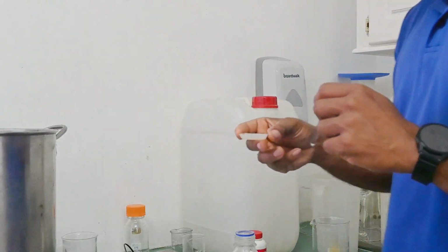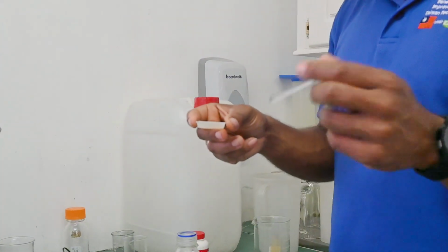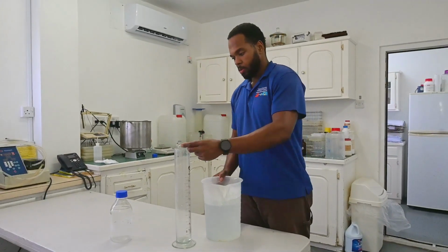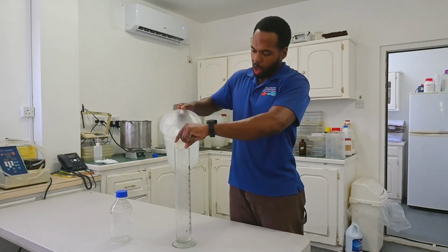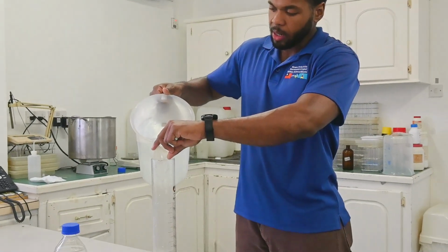The next step will be to add it to a measuring cylinder and add the final volume of water till it goes to 1,000 milliliters. So now we're going to pour out the BA and we're going to add water to bring it up to the final volume of 1,000 milliliters.